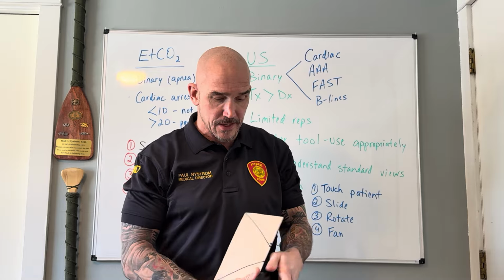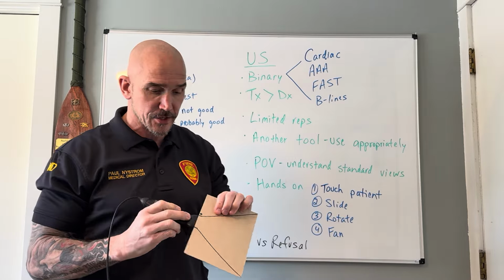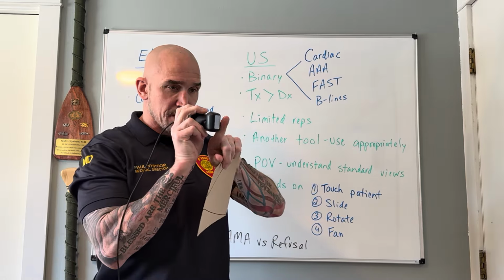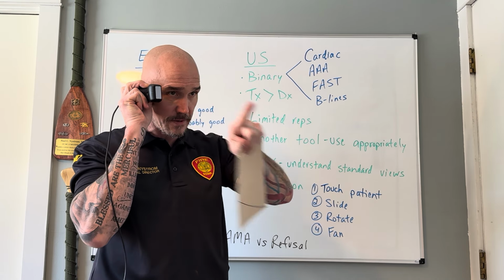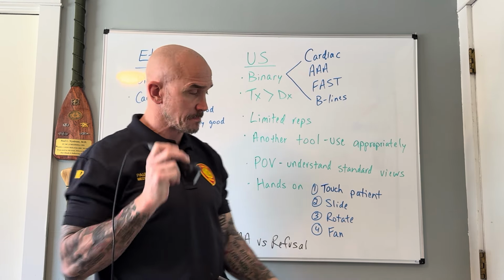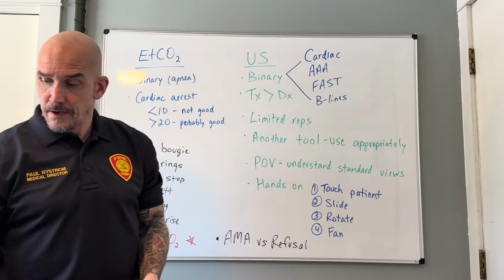So you have to make that adjustment in your head, but understand that you're seeing the thin beam come out of the ultrasound probe and you're looking at it from the side. You're not looking at it with the same point of view as this, right?